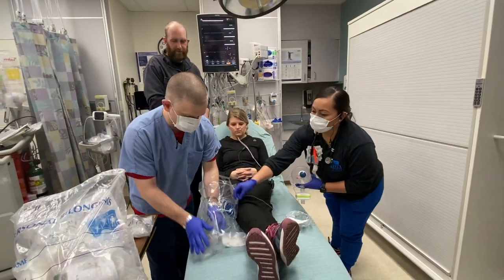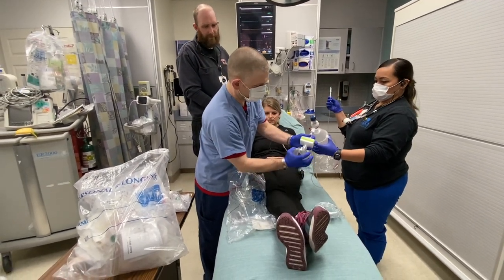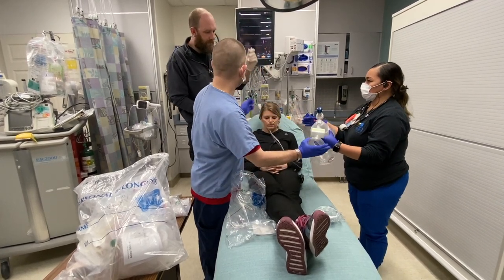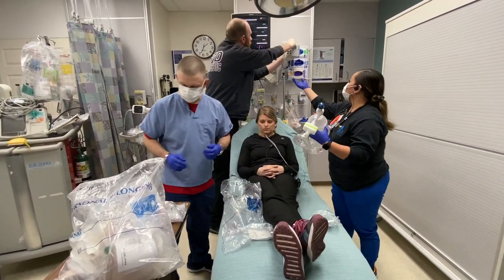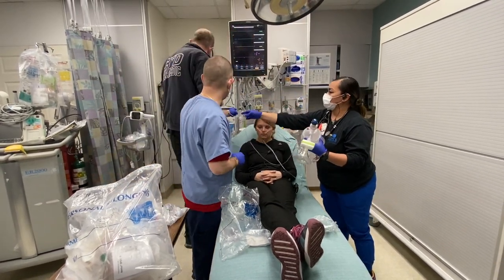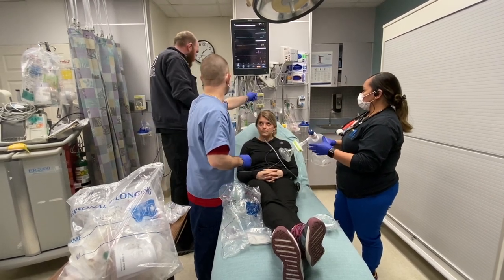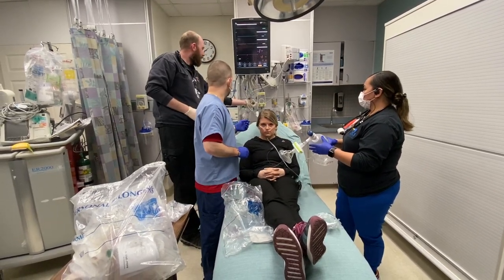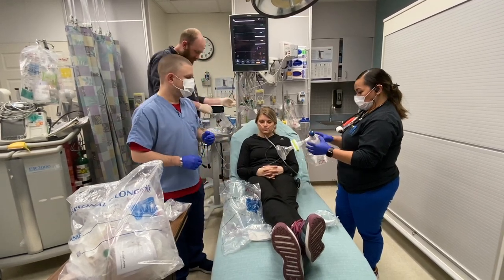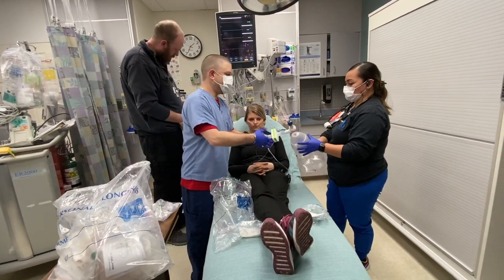And then inside here, we have a standard adult mask. Okay? So we hook that up. Make sure these connections are nice and tight. Hook that up to the end-tidal CO2. That's the portable one. So we have that on the flush rate oxygen at 25 liters a minute. Yes. Let's turn it up. There we go. Good.